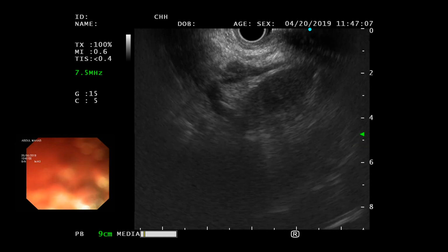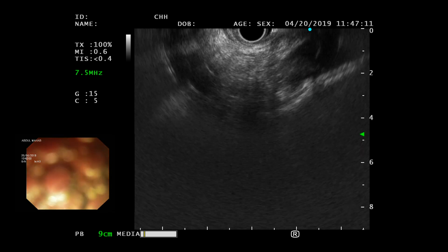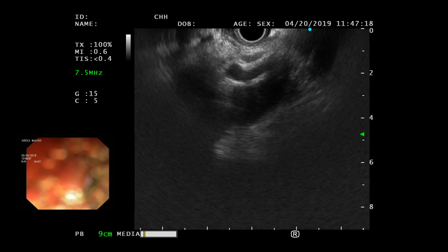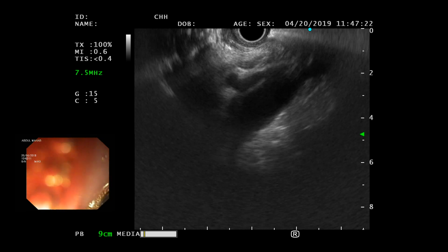There is the adrenal gland. You see clearly it's separate from that. Yeah. Okay. So that actually is a ganglion. If you don't see any fluid, any flow in that, that has to be a ganglion. And different ways, if you see a ganglion, it may be preferable to inject right into that.